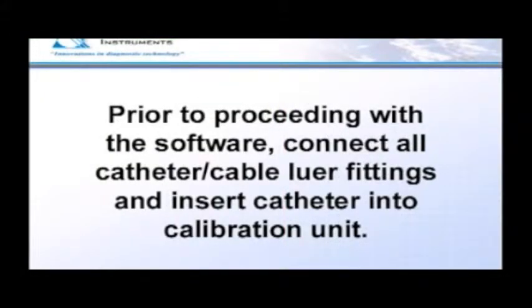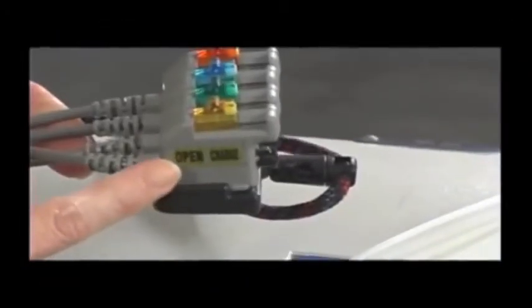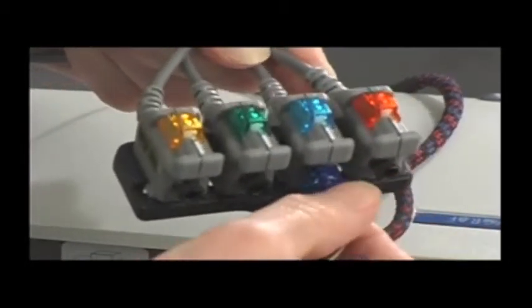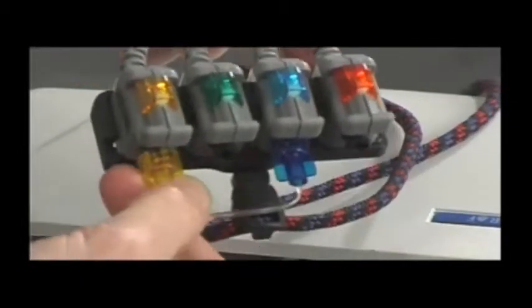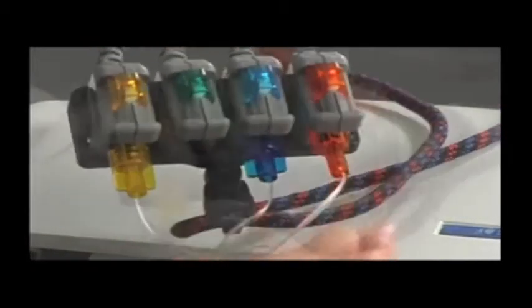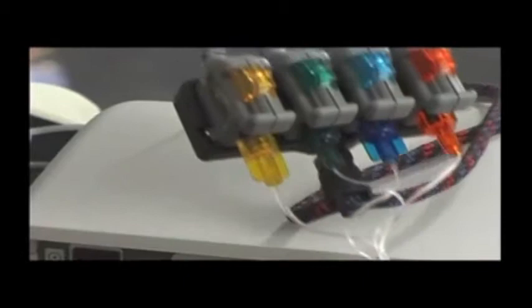Click on that also. Prior to proceeding with the calibration software, it is necessary to hook up the air-charged catheter onto the cable and to insert the catheter into the calibration chamber. Use the following instructions to complete these steps. It is very important to make sure prior to connection that the adapter cable block switches are set to the open position. Attach the catheter to the cable by twisting each luer connection together. Make sure they fit snugly so that an airtight seal is ensured, but avoid over-tightening, which could crack the plastic luers. Also, take care not to kink the thin tubing located between the connectors and the catheter body.